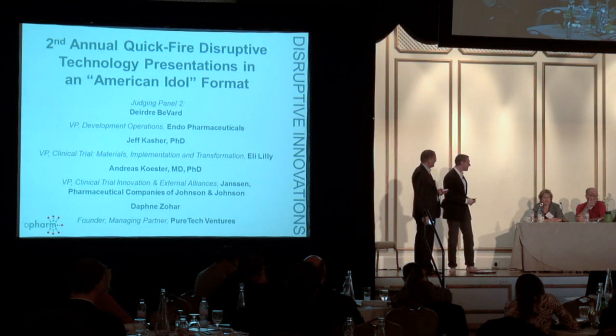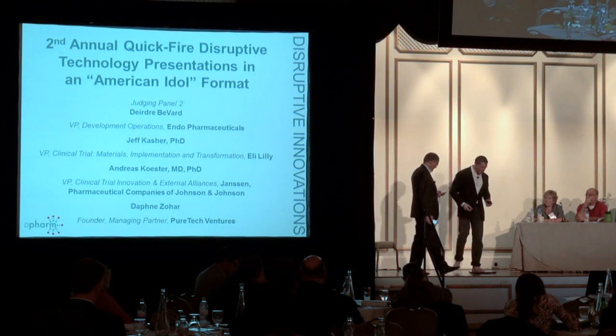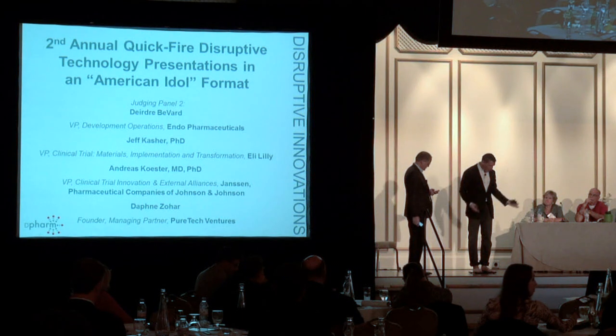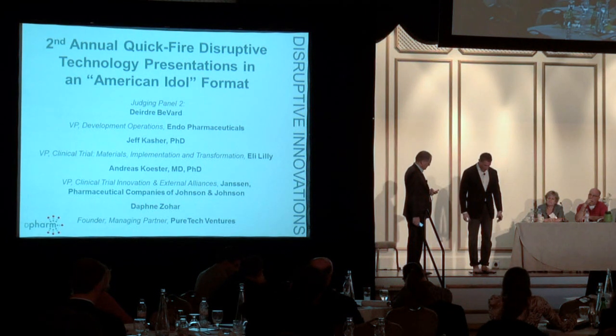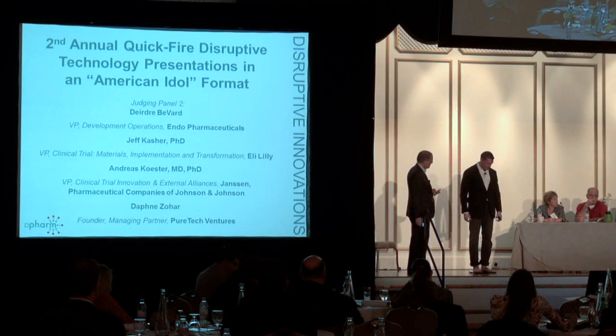Questions? So you said that it measures your body fat? Yes. How does it do that? That's why I'm barefoot. So it sends an electrical impulse through your body. It's actually a pretty standard technique in a lot of these athletic scales. So I am 190-something pounds. And if I stand still enough, I'll get my body fat as well. And there's a whole bunch of different sensor technologies out there.